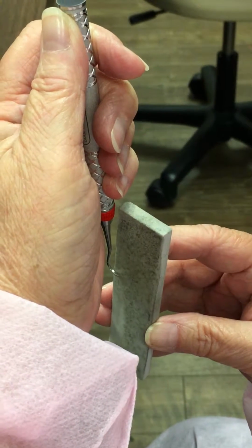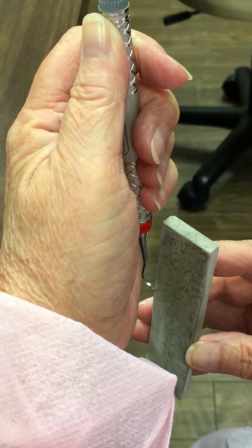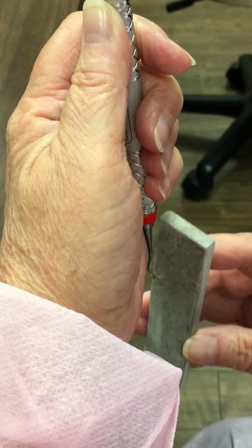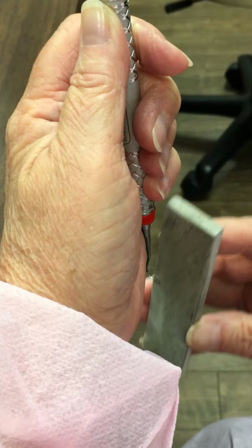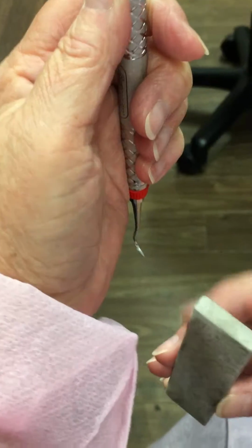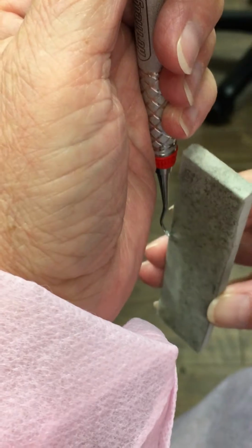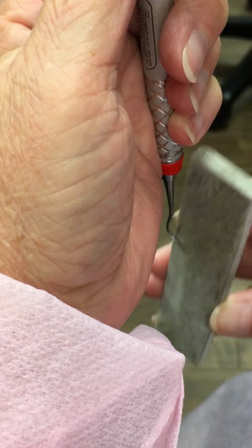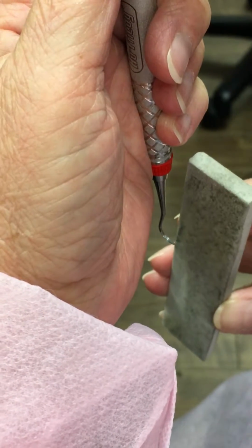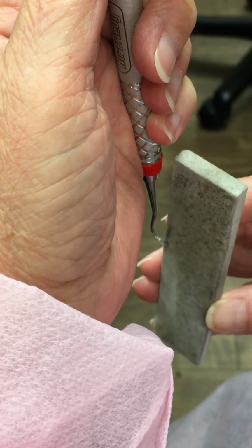You want to divide the instrument blade into thirds, so you have the back third, the middle third, and the toe or terminal third. I usually start at the very back, and I go up and down until I hear a high-pitched noise or I see sludge on the instrument. Then I move to the middle. I start at 90, open slightly to 110. And then to the terminal third, start at 90 and open to 110.